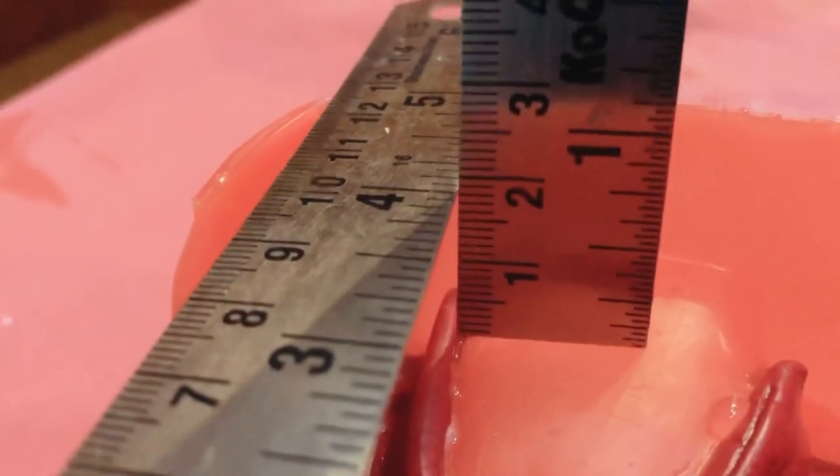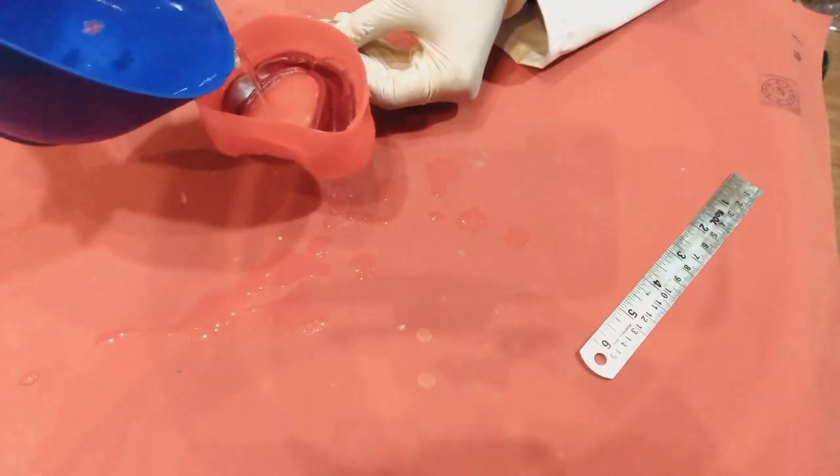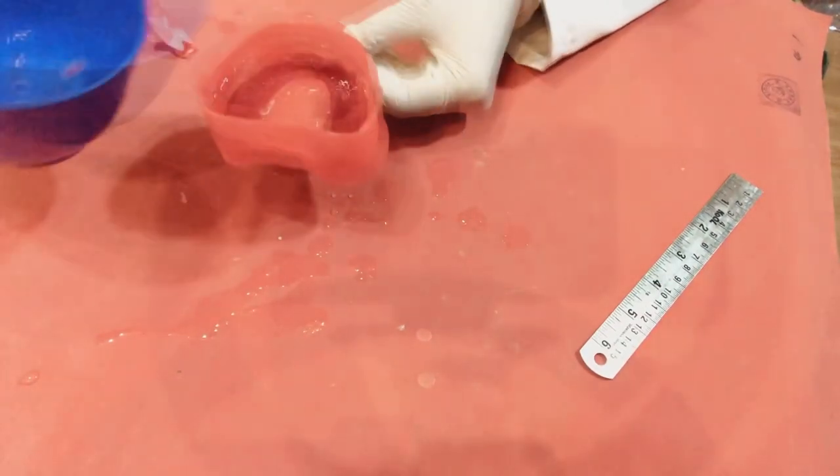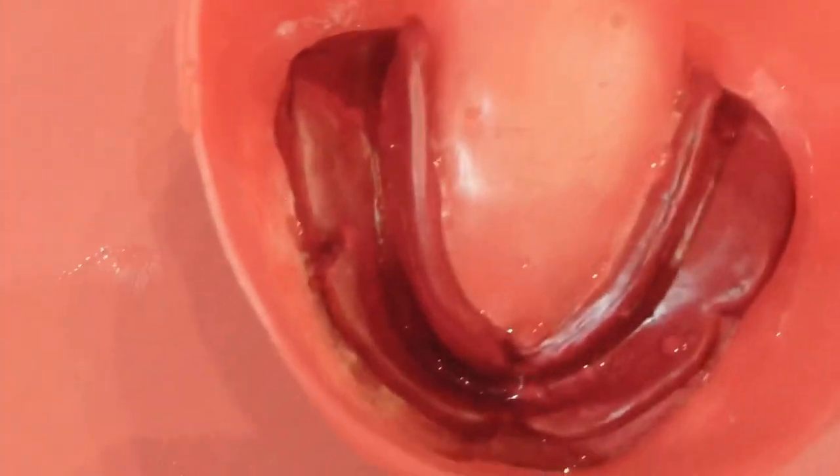Before winding up, check that there are no leaks by pouring in some water. That's the mandibular impression with beading and boxing completed.